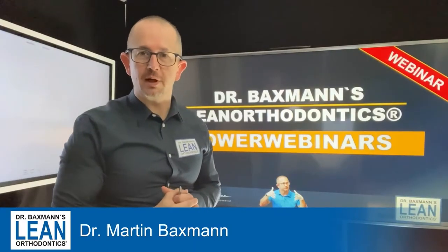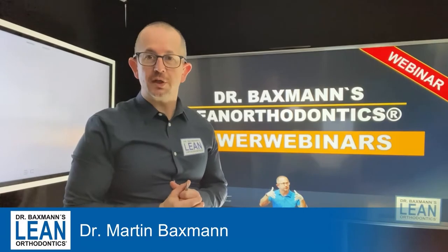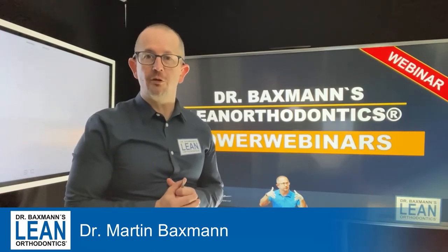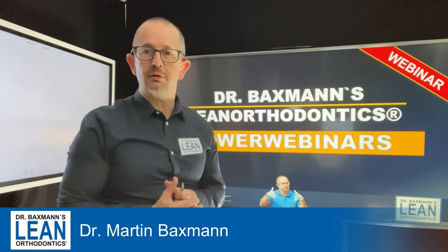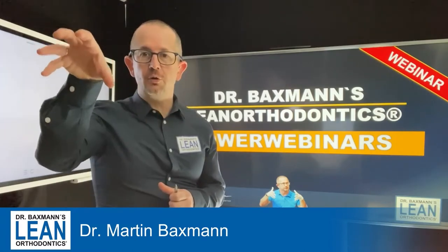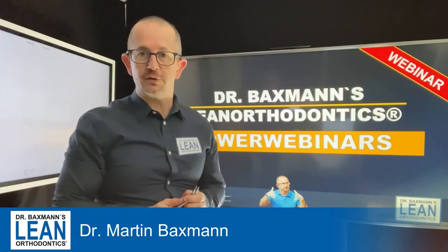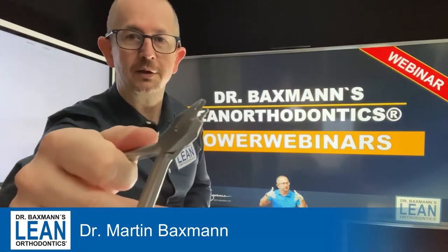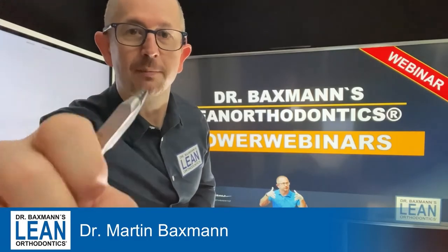Welcome to my power webinars in lean orthodontics. My name is Dr. Martin Baxmann. Today we are going to talk about wire bending again — it's a bend for the three that's in crossbite and needs to be brought beyond our occlusion to get into the right space. What you need today is 018 stainless steel wire and a loop bending plier. Let's get ready for some action.